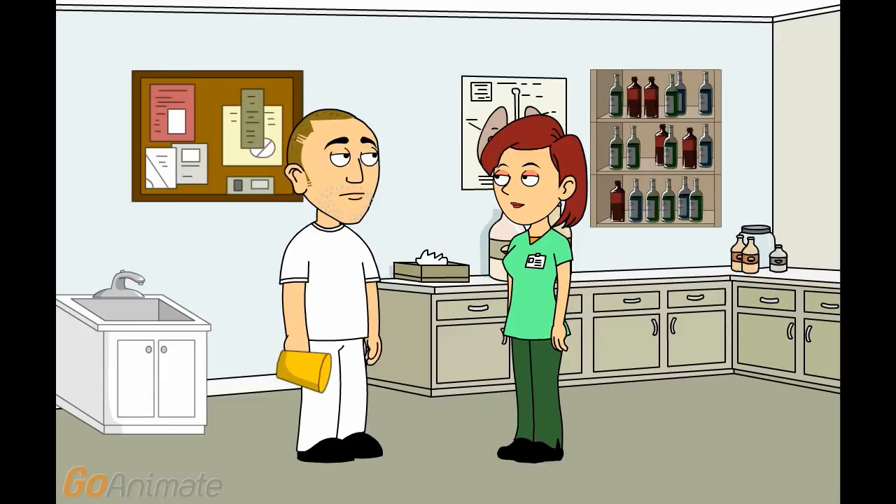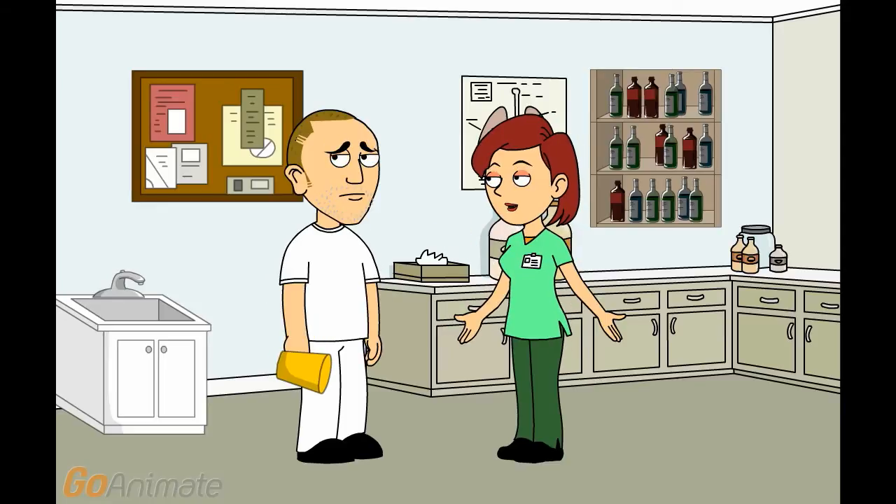Before we test the urine, tell me about the appearance of the urine. What does it look like? Well, let me see. It's yellow. Not too dark. It's not very clear. So, straw-coloured and a bit cloudy. When you take the lid off the sample, make a note if the urine is smelly or not. This sample is a little offensive. Yes, it does smell a bit.